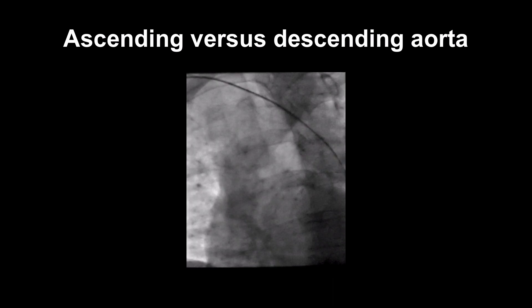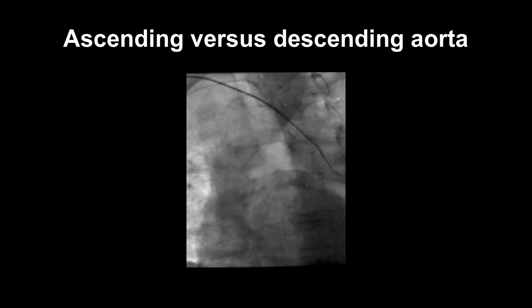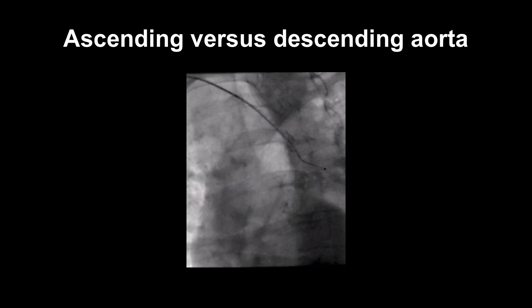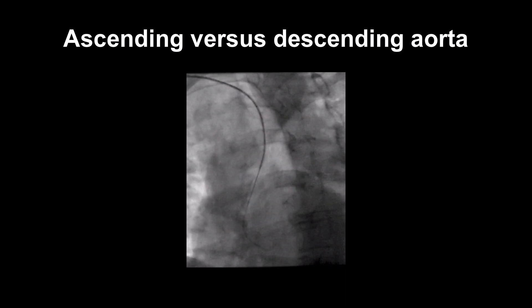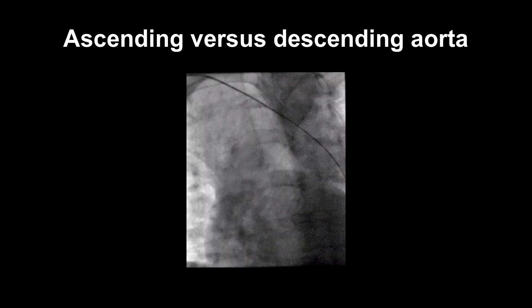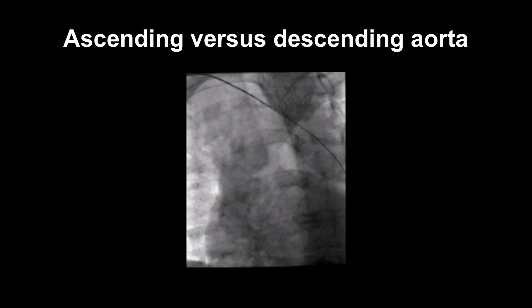Sometimes the J wire and catheter go from the arm straight into the descending aorta, rather than the aortic root or ascending aorta. If this happens, as you can see on the video, it's best to change to a left anterior oblique or LAO view and pull back the wire and catheter.